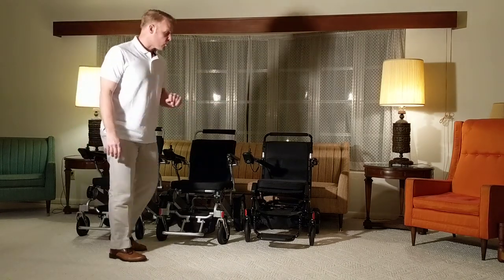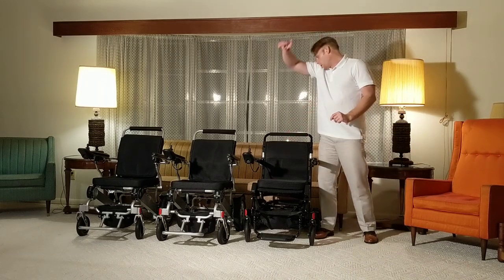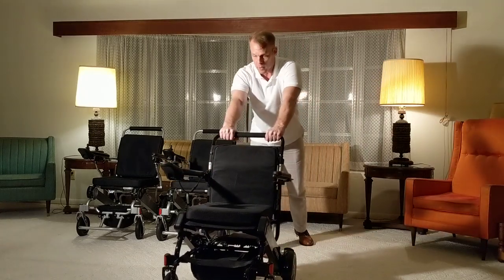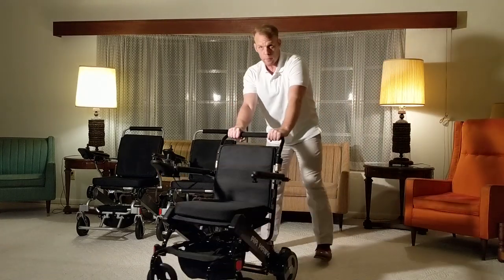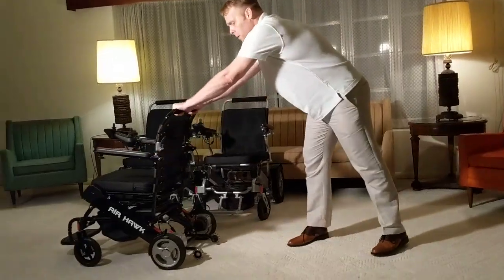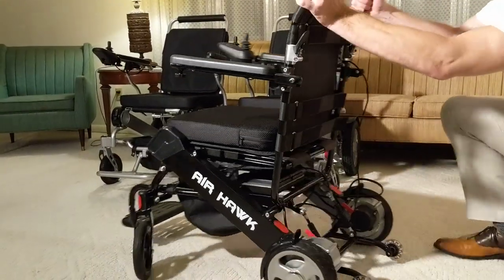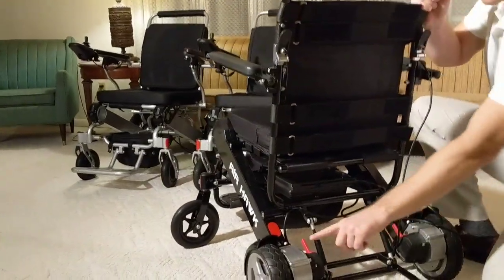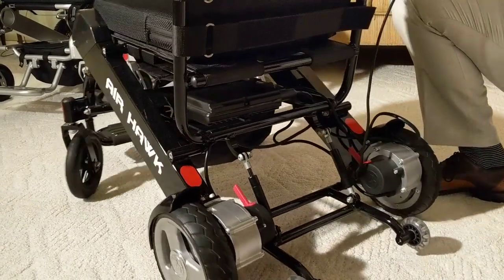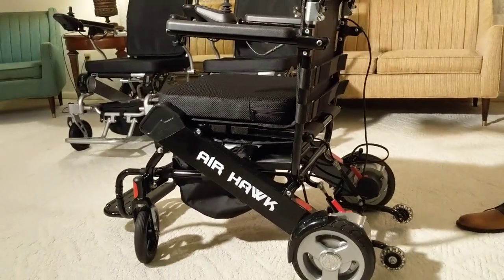Let's take a closer look at the Airhawk folding power wheelchair. The Airhawk has the ability to go into freewheel mode. On the back of the chair, you have two little red protrusions that look like light switches — with the flick of a switch, you've successfully locked the wheels and you're in power mode.